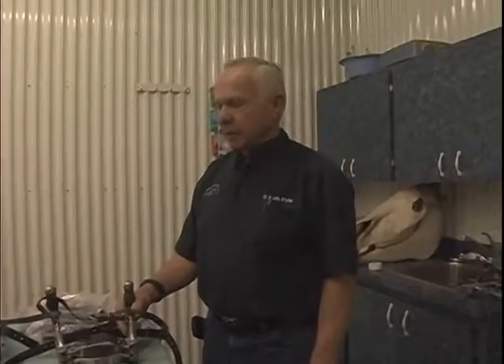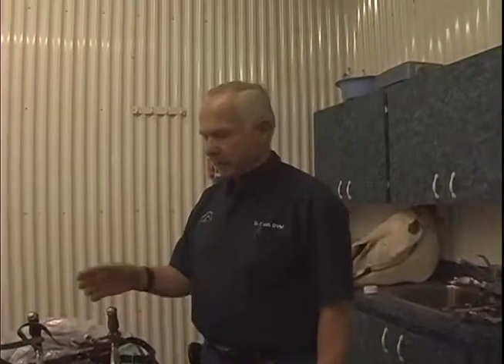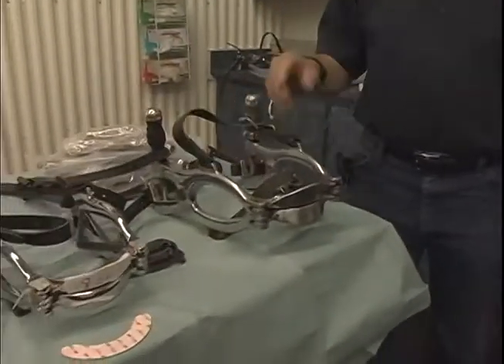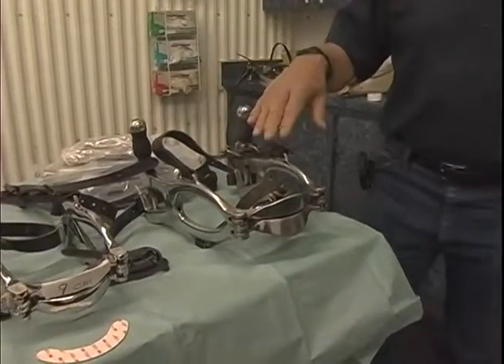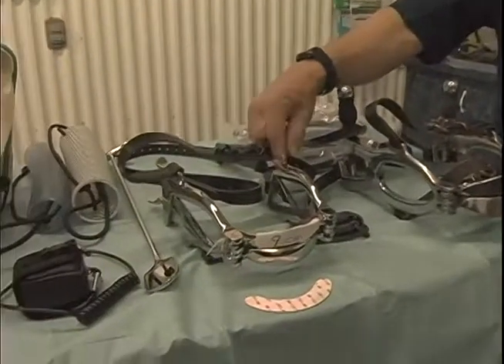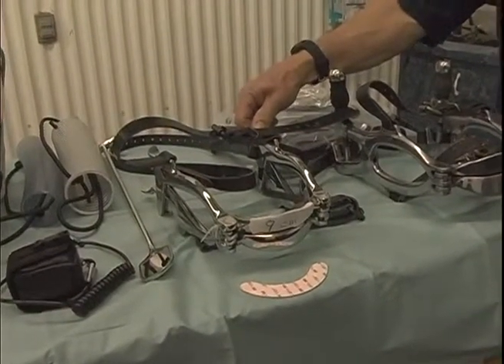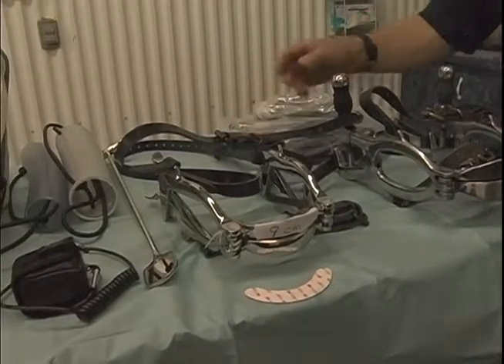First thing we will do is demonstrate PowerFloat accessory equipment, and we will begin with the Speculums. PowerFloat makes two Speculums. One is a wind-up version, and the other one is a more traditional type Speculum that in North America we call the McPherson. In Europe it's probably called the Houseman, and it has ratchets on the side.